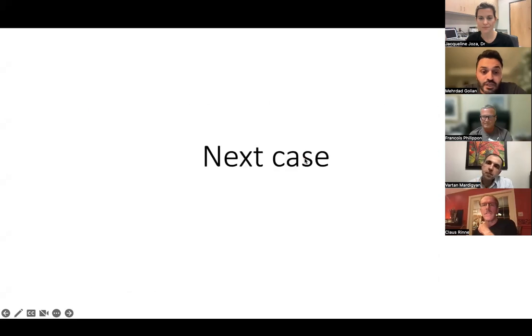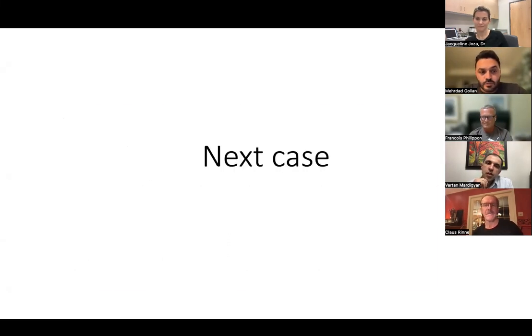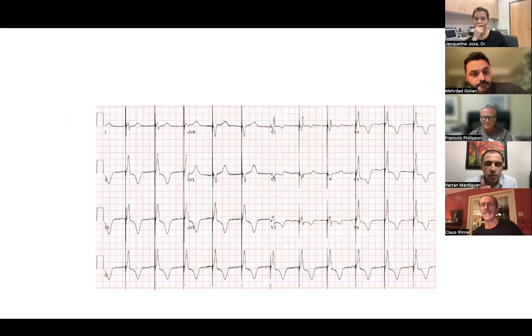Great. Incidentally, would anybody else, all those T-wave changes, do people see those all the time? Some kind of T-wave memory, you're changing depolarization dramatically. If you just go back, you see these. Initially, sometimes. Yeah, fairly dramatic often, eh?